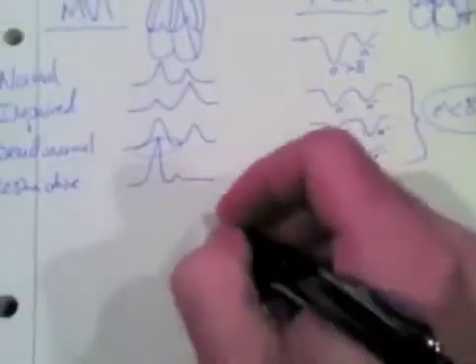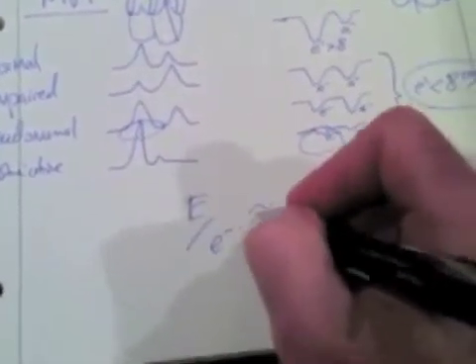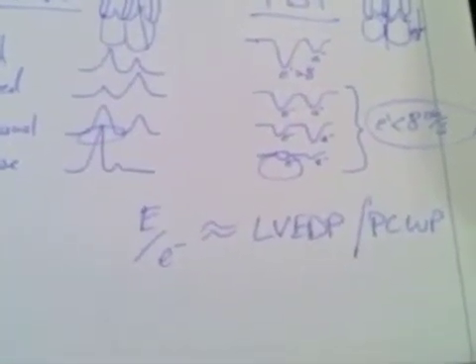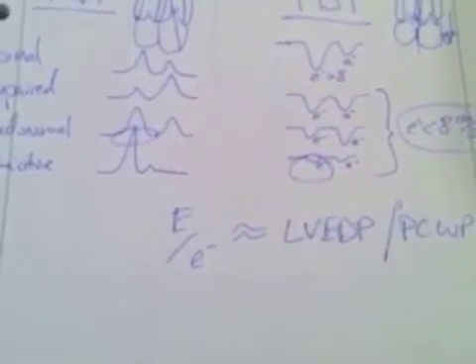The last thing that I'm going to tell you is that the velocity of this E over the velocity of this E prime, or E over E prime, is pretty much equal to your left ventricular end diastolic pressure, also known as your pulmonary capillary wedge pressure. So that's just one more way that we can use echocardiography in place of a Swan-Ganz catheter to get some of the same information we're used to seeing.